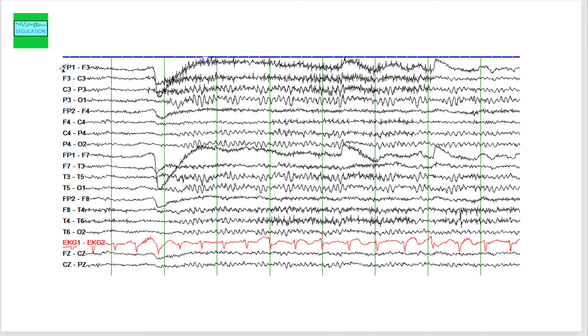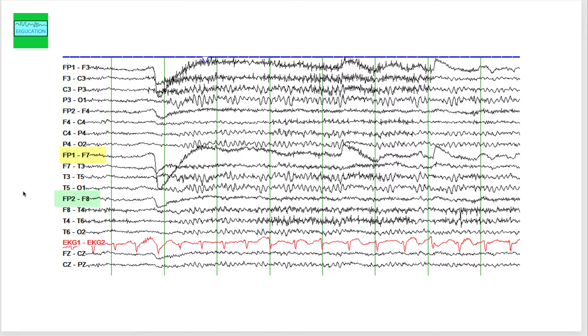Compare fp1 f3. Compare this channel which is recording from the left frontal region with fp2 f4, and then compare fp1 f7 with fp2 f8. What is the difference that you see? The basic abnormality, not quite an abnormality but the artifact or the asymmetry that you see here, is an asymmetry in the eye blink artifact.